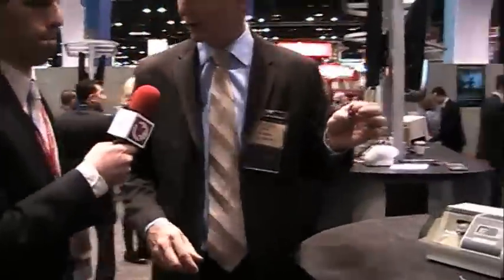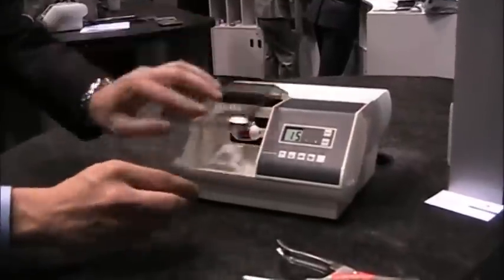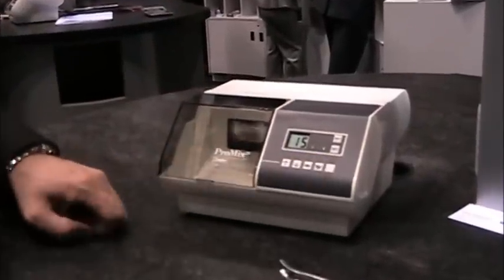Our Chem Fill Rock comes in these small capsules. You activate the capsule by pressing it down on the countertop, and then it goes right into our ProMix Amalgamator. We're going to triturate this on high speed for 15 seconds.